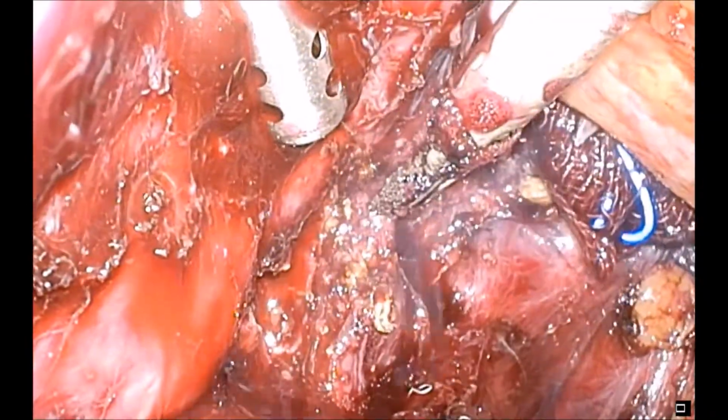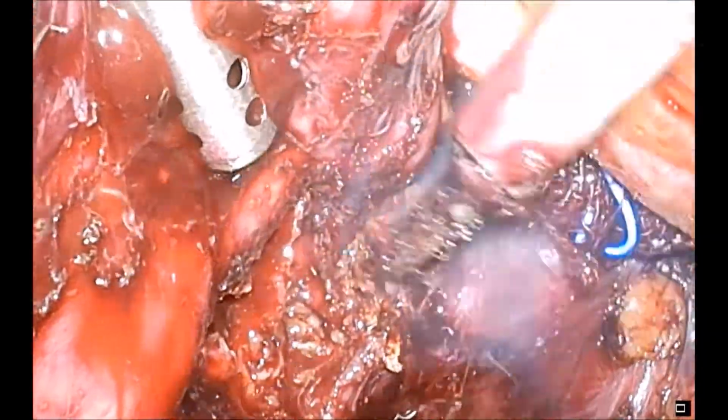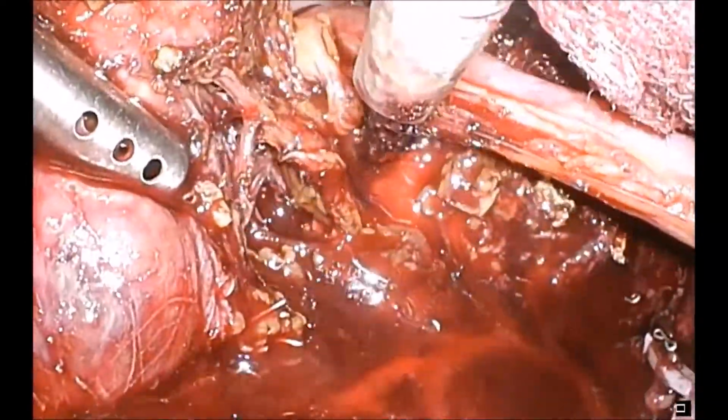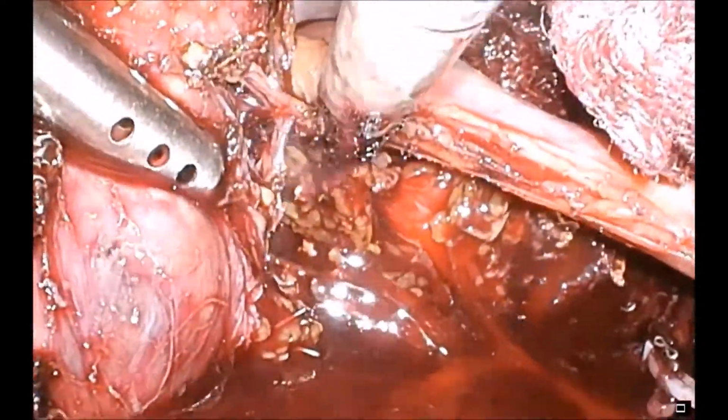A little capsule at the back of the caudate lobe is divided just to thin things out a bit more. You can see the inferior vena cava bouncing away at the back. That artery again annoyingly slung over.